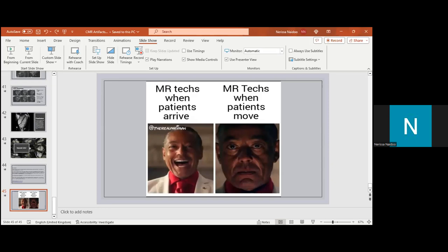So this normally we would do at the very start before your cines. After you do your transaxial throughout the chest, and when you go in to plan your cines, this is when we would do it to make sure that your cines come out all perfectly beautiful without that frequency shift artifact. Thank you for your question.